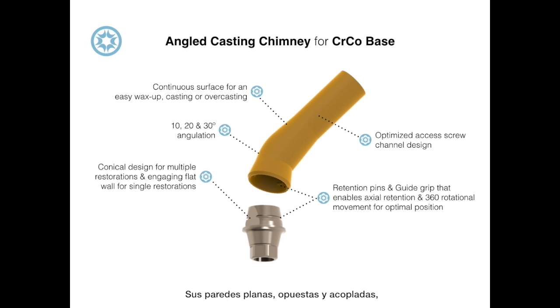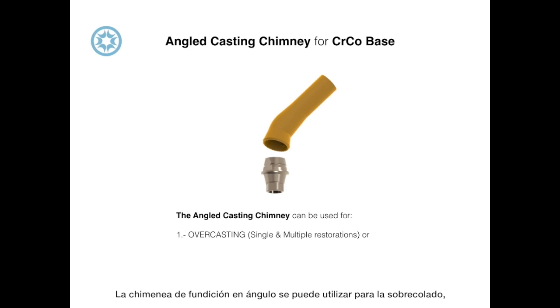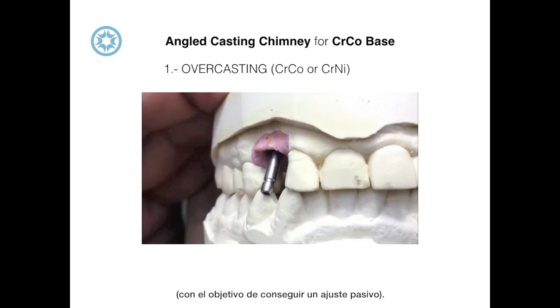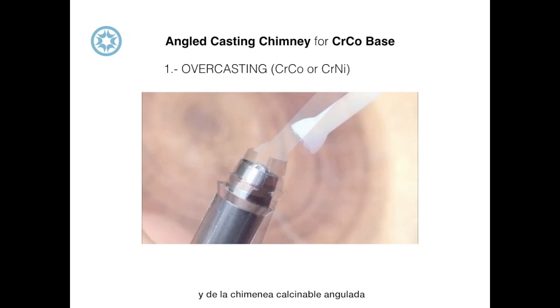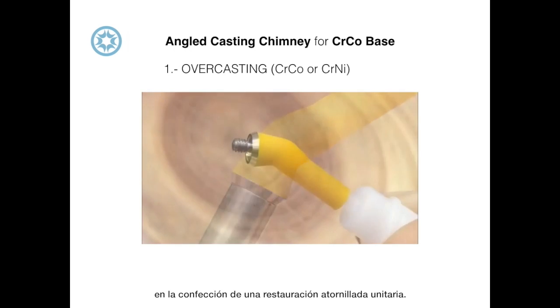Its opposite engaging flat walls prevent rotation in single restorations. The angled casting chimney can be used for overcasting as well as separate casting and laser welding. This video demonstrates the overcasting of the cobalt chromium base in the angled casting chimney in the creation of a single screw retained implant restoration.